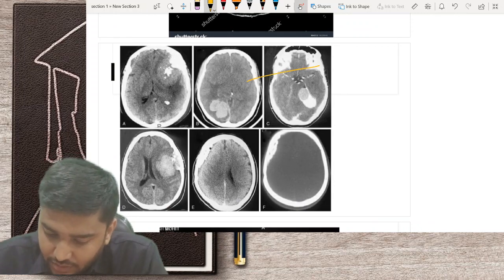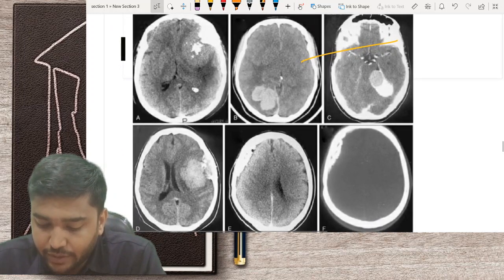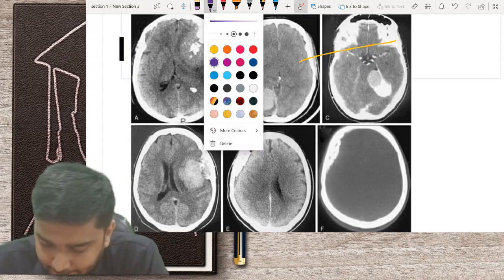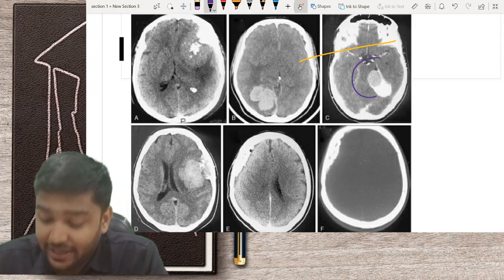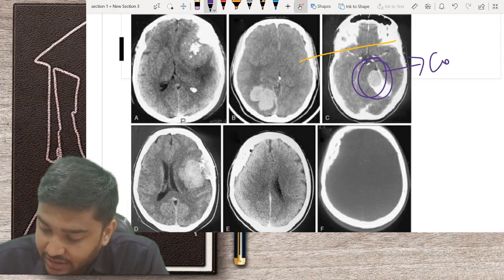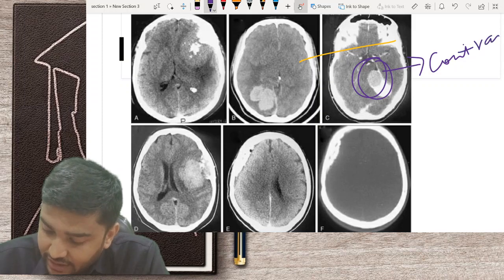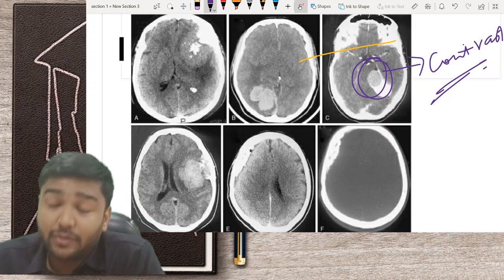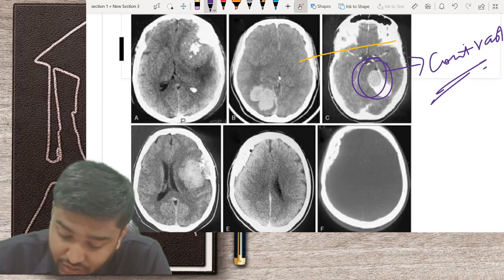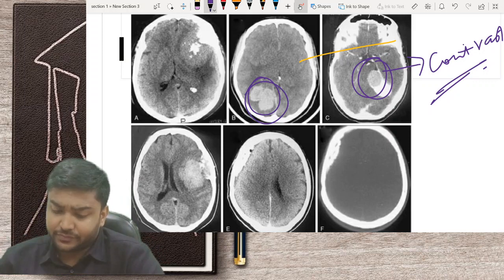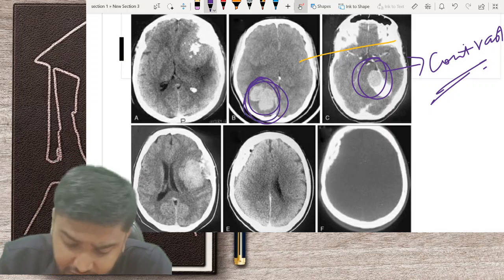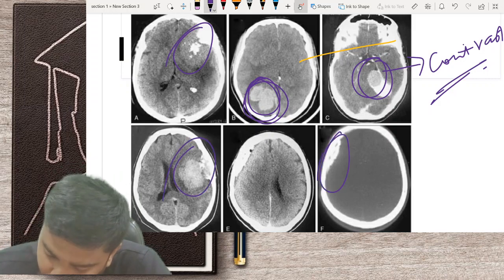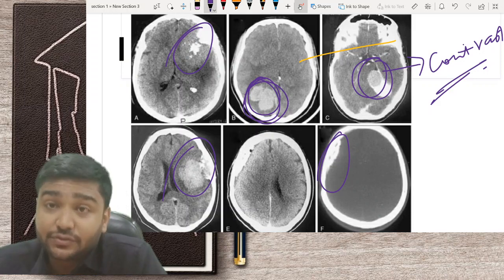Regarding the importance of CT in brain tumor conditions — here you can see a CP angle meningioma which is contrast enhancing: it takes up the intravenous contrast dye. Here is another meningioma — a sphenoid wing meningioma — and here is a convexity meningioma with hyperostosis. Whenever you give IV contrast in CT, any tumor present will take up the contrast.